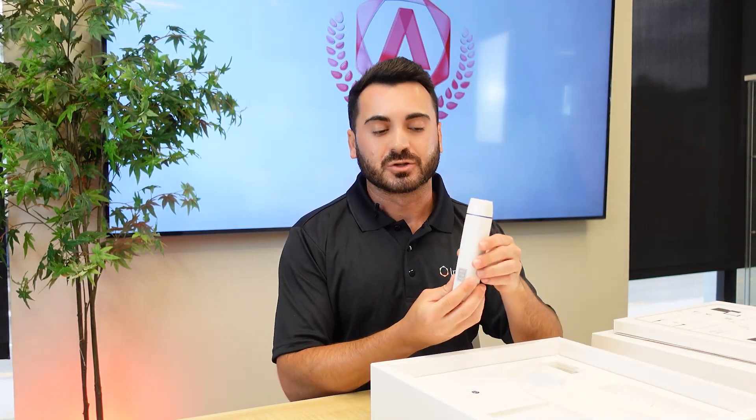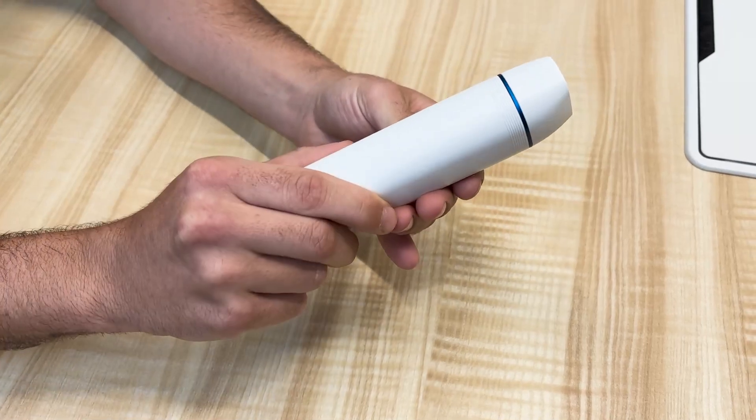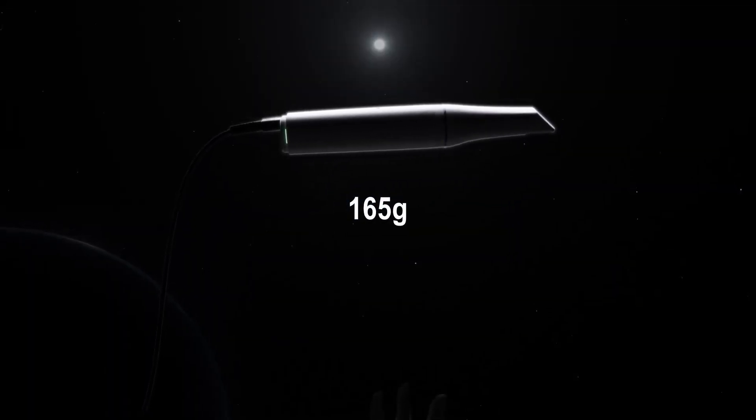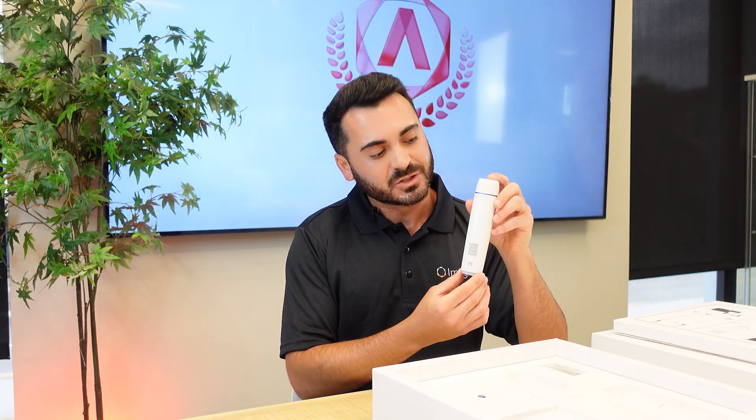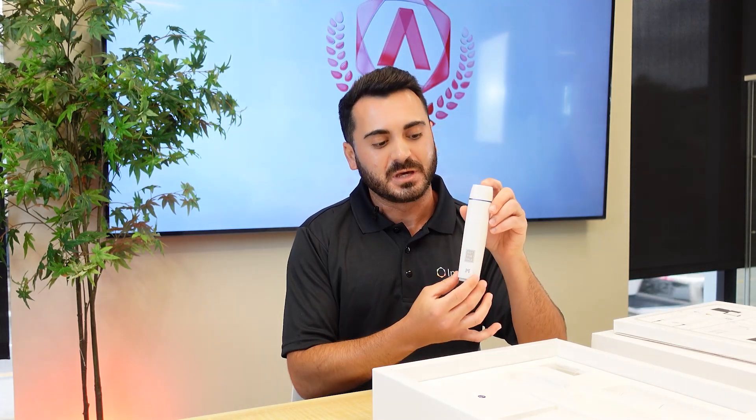Below that, we have our actual intraoral scanner, the i900. This scanner has been significantly reduced in both weight and size compared to other models, coming in at about 165 grams and 35 millimeters in width. It also has a unibody and symmetrical design, essentially meaning that it is made of one solid piece with no joints.